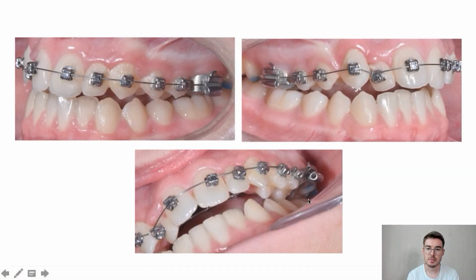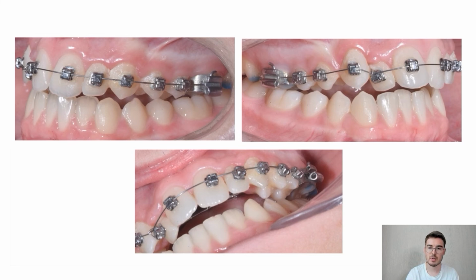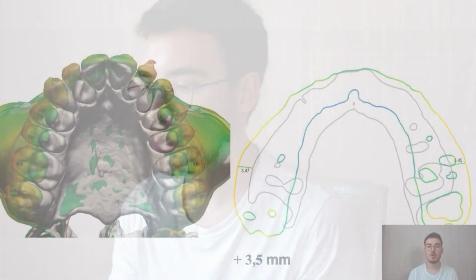It was almost a crossbite, but remember that we will put the braces on the lower jaw, so there will be no crossbite, or even the tendency for a crossbite will be corrected. So don't be afraid of it. In fact, very often there is a completely opposite situation when we do not put the braces on the upper jaw and start working with the lower jaw. We will also talk about this, but this is a separate topic.